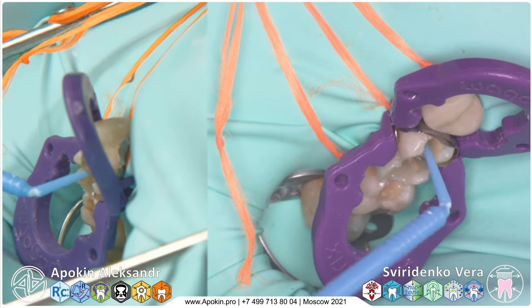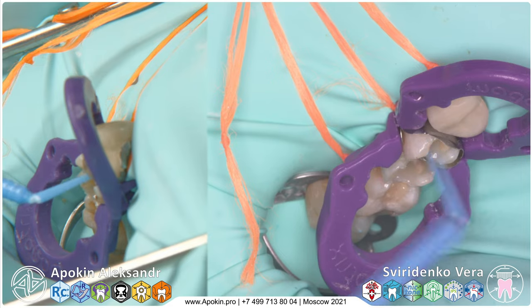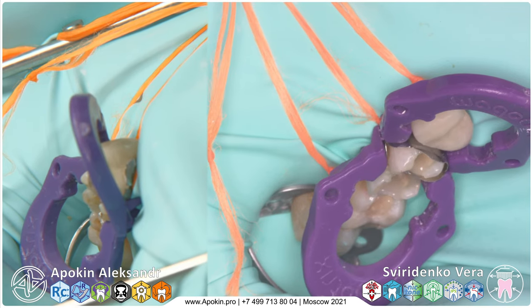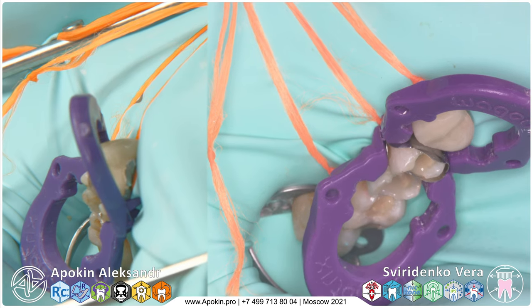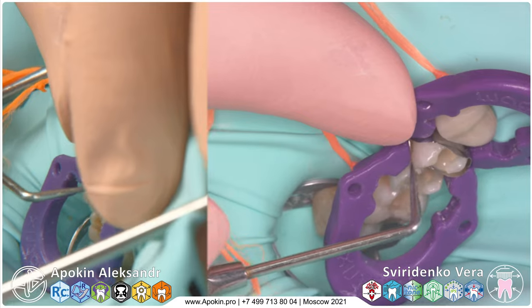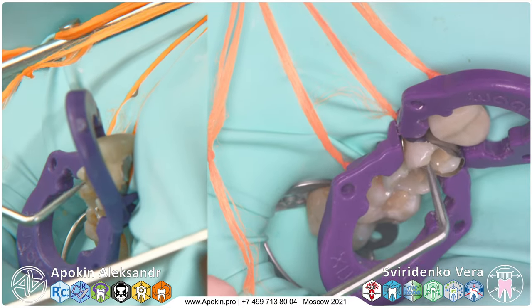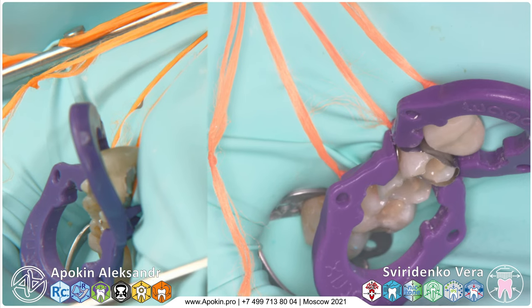So, what is the most difficult part during this work? I think this is the preparation. Make preparations carefully, not to destroy the rubber dam or dental parts. Clean all hard tissue surfaces, it's very important. And be sure that we can rebuild all these surfaces from composite.